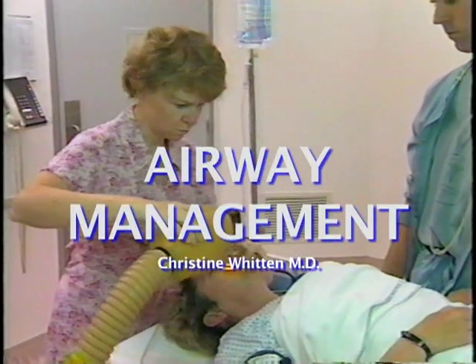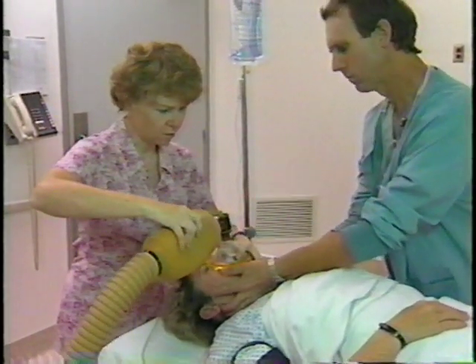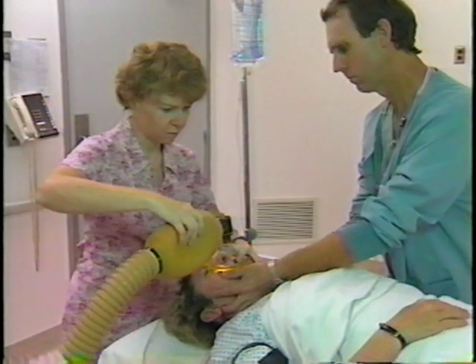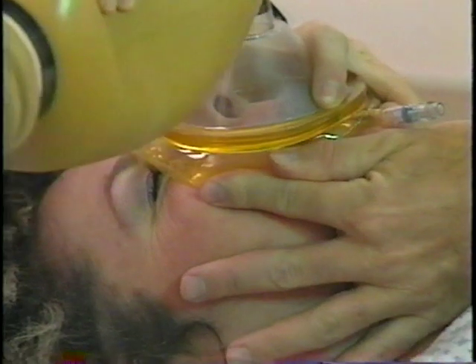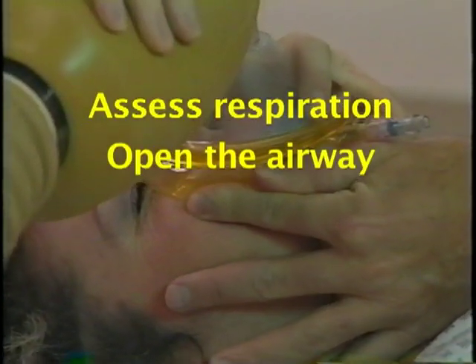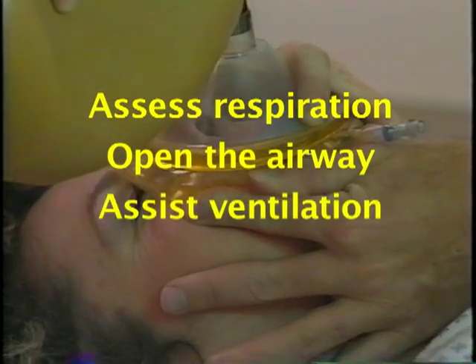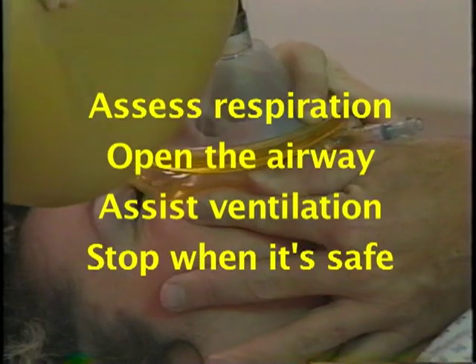The ability to open an airway and to ventilate a patient with a bag valve mask apparatus are skills that frequently save lives. To effectively manage the airway, you must be able to assess your patient's respiration, open the airway, manually assist your patient's ventilation, and stop ventilation when it's safe to do so.